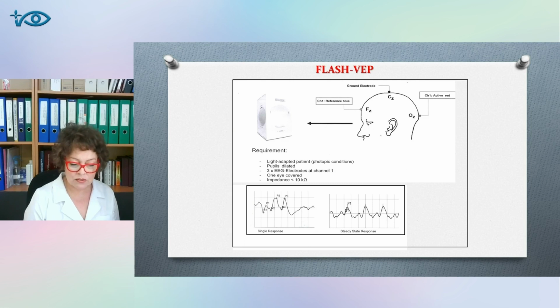In the diagnosis of brain tumor, on the side of the volumetric process, signs of irritation are revealed in the form of an increase in the amplitude of flash VEP responses associated with an increase in epi activity of neurons in the focus area. With complete atrophy of the optic nerve, flash VEP are not recorded at all.